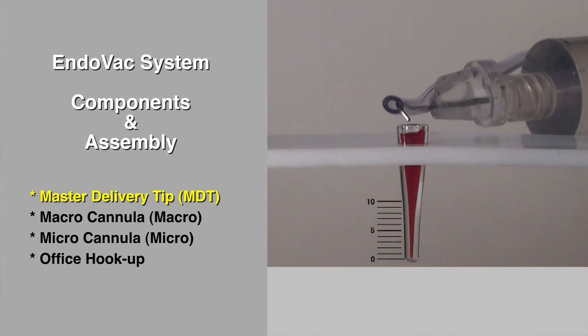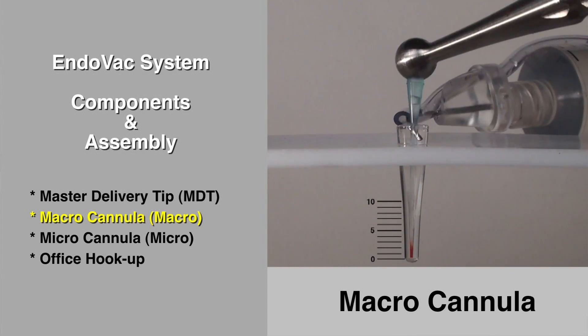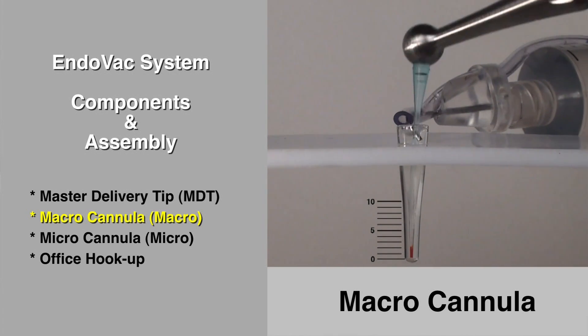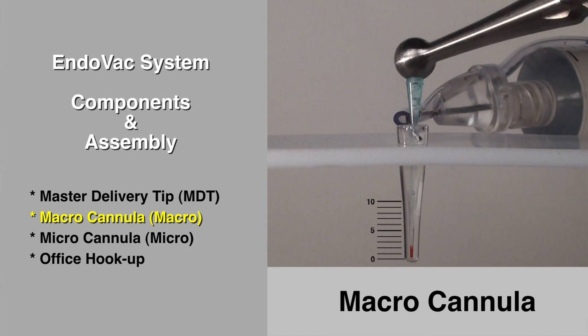Immediately following instrumentation, the macro cannula together with the master delivery tip exchange a huge volume of irrigant through the root canal system. This combined action almost instantaneously clears most of the root canal system except in the last two millimeters. Please note that even though the macro cannula only goes to about 5 millimeters from working length, its vacuum effect almost reaches full working length.